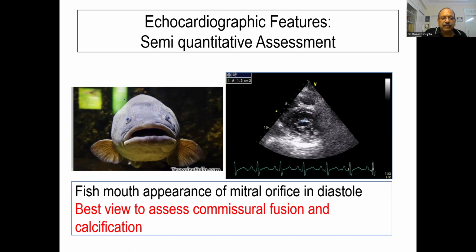Sir, sometimes we find in case of mitral stenosis that the commissures are partially fused. So what will be our approach in this patient? If commissures are fused, they are not calcified, I'll go and open them up. Fusion is accepted. Calcium is not accepted. Okay, sir. Thank you.